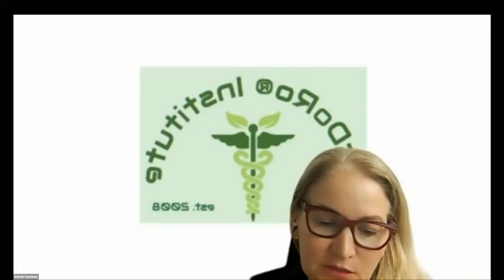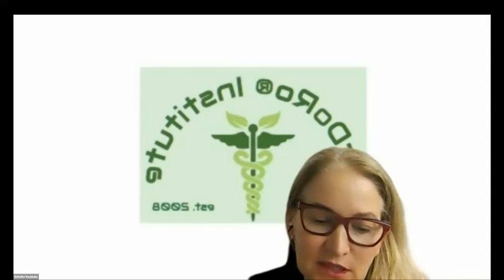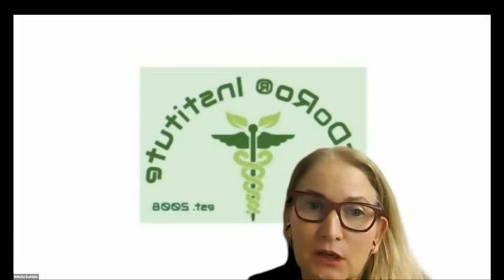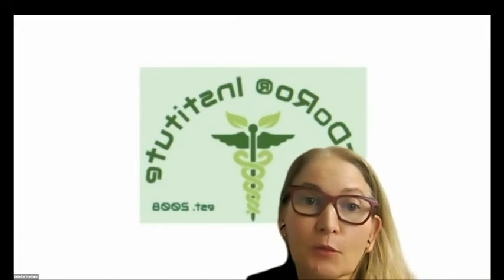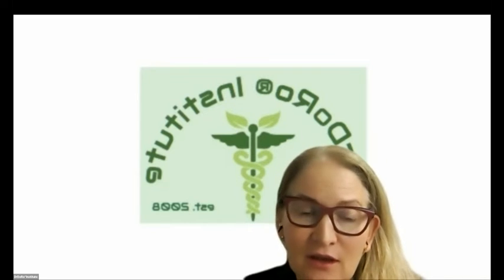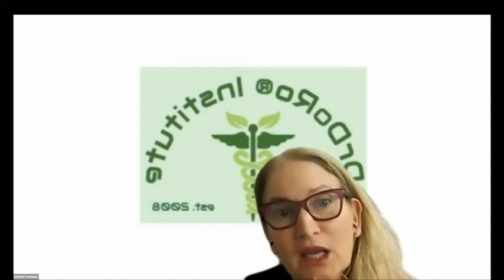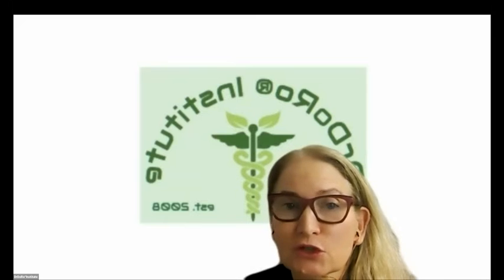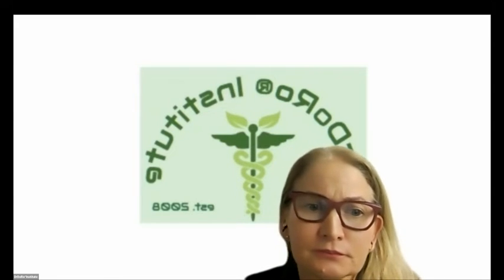And then one last question is about the process itself. Right now our surgeons have to be in the room with the patient with the Da Vinci to perform the procedure. The idea actually was to use it on a combat field so that the surgeon can be somewhere else in the world. That's now not the case. So would you be able to utilize specialists all over the world to do procedures away from the locale? Our vision is that the physician is still going to be around.